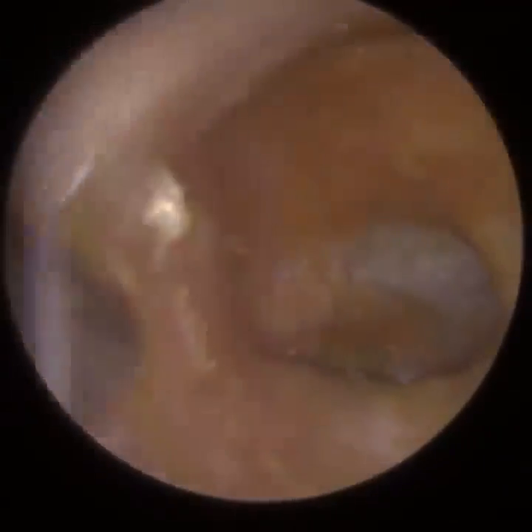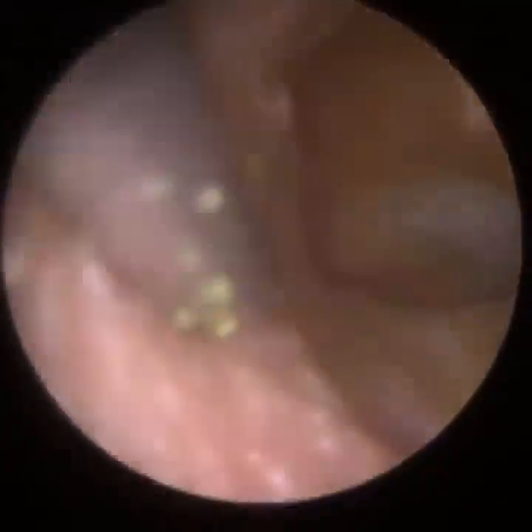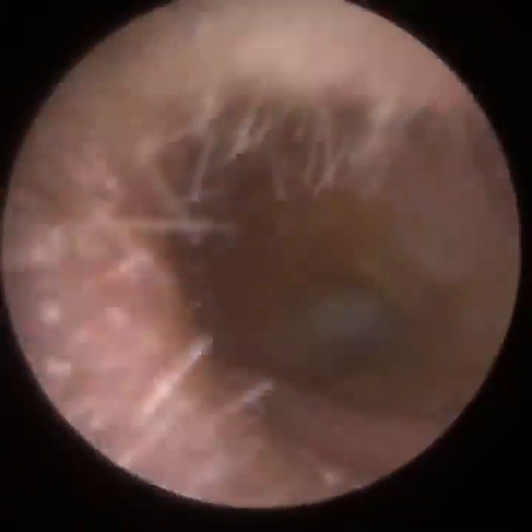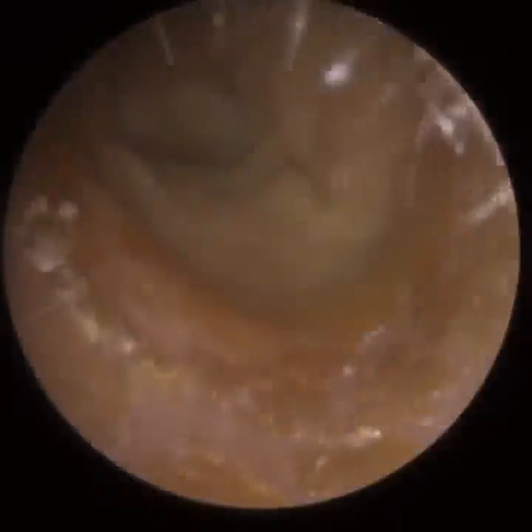Some of you may be wondering, why don't you just flush it out, using an irrigation or syringe method? In the UK, syringing and irrigation, GPs and doctors have just stopped performing that completely now, more or less. The gold standard here is suction, as there are more inherent risks with irrigation. You're more likely to develop tinnitus, infection, and also when you've got an infection already, you do not irrigate the ear, you're just going to make it worse.